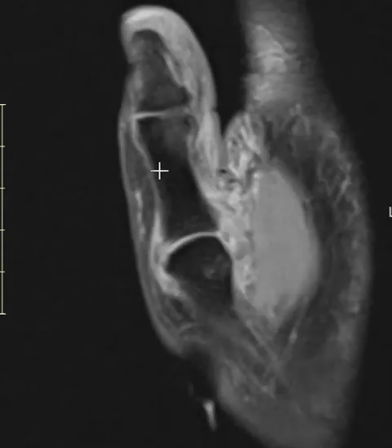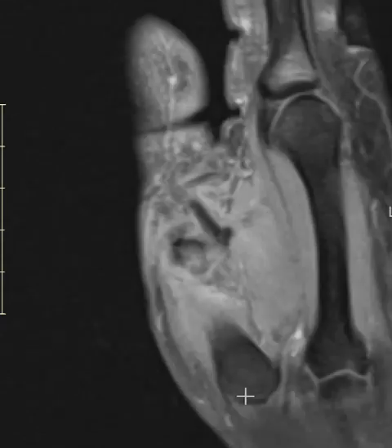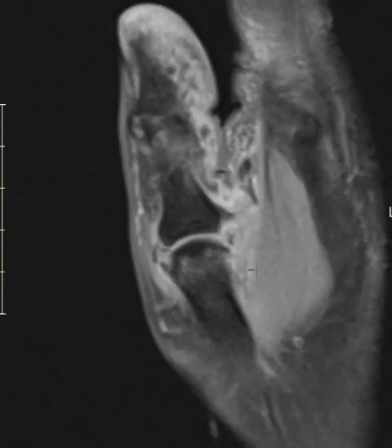This is the distal phalanx of the thumb, proximal phalanx, and this is the first metacarpal bone to get oriented. These are the thenar muscles here, and this is the ulnar collateral ligament. We should see a linear band that's dark here.